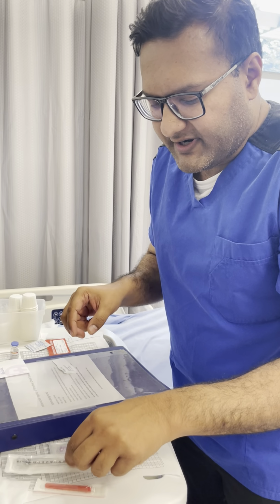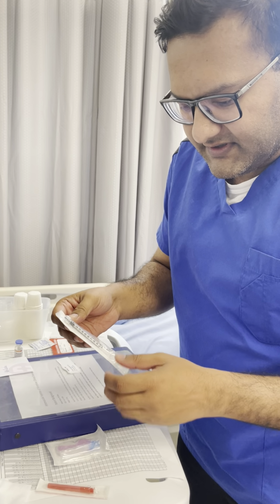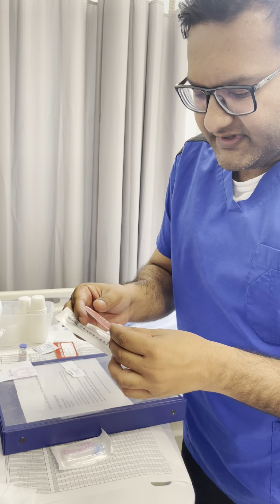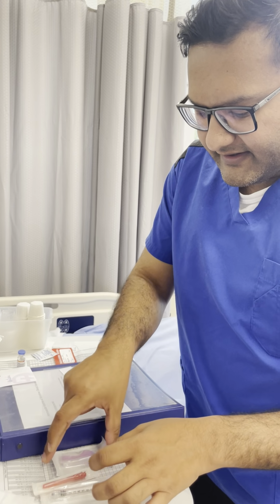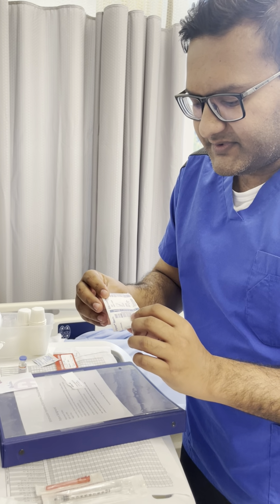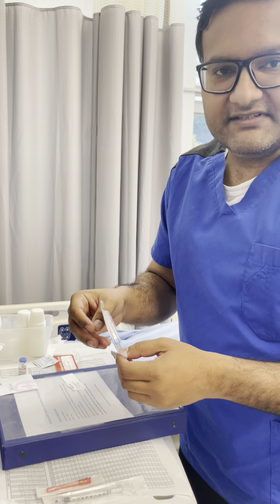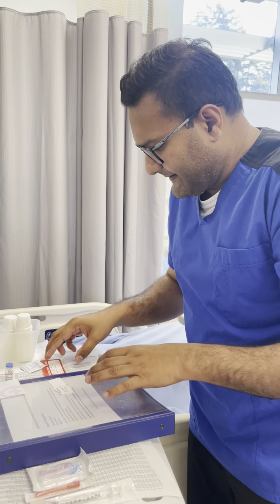For my equipment today, I will be using a 1 ml syringe. To retrieve the morphine from the vial, I have a blunt fill needle. To apply the intramuscular injection, I have a 23 gauge 1-inch needle because it will be applied to the deltoid muscle.